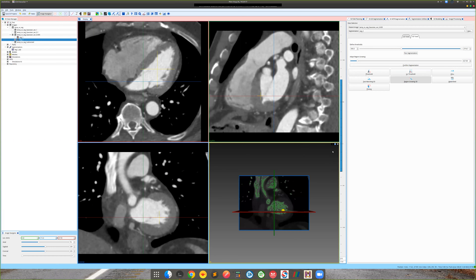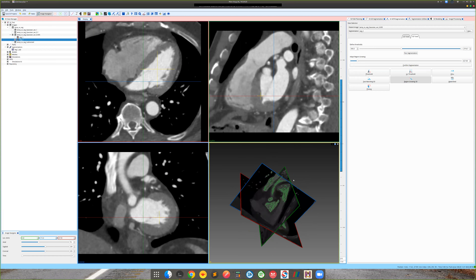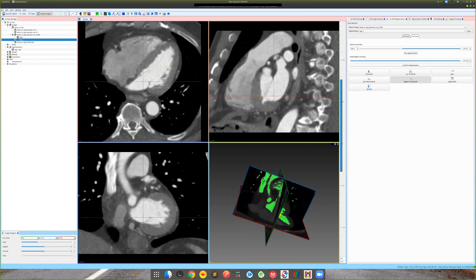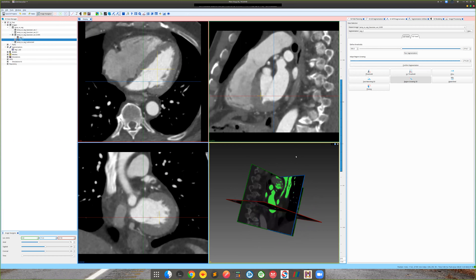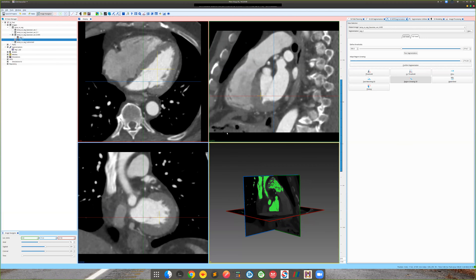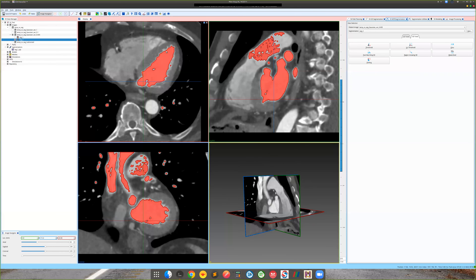To display the result, show the crosshairs. You can see it's only including regions within the left ventricle — not including the right ventricle, which is expected. Apply 'Adapt' to fill the cavities. There are still some cavities not properly filled, but clearly only the left ventricle is included, along with a little bit of vena cava that can be cleaned up later. Confirm and save the segmentation — clicking another option without saving will lose it.